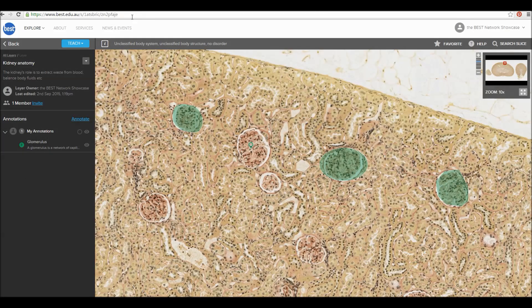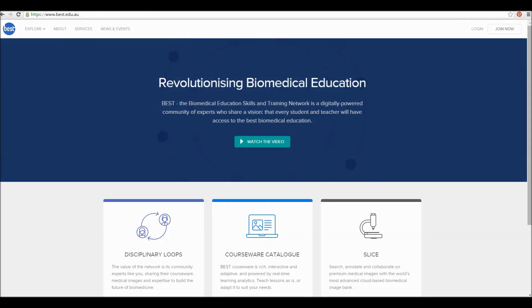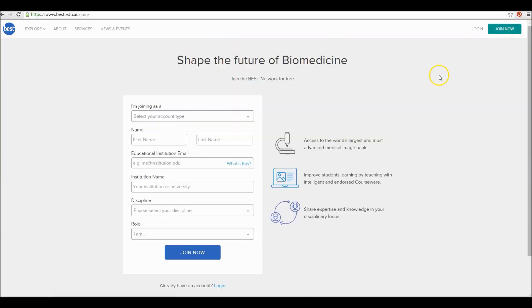To share an image or annotation layer without inviting someone, simply share the URL by copying and pasting, or click the Share icon while viewing an annotation. Annotating and sharing images on Slice is a fun and interactive way to learn. Log in and get started today. If you'd like access to Slice, click Join Now to join for free.